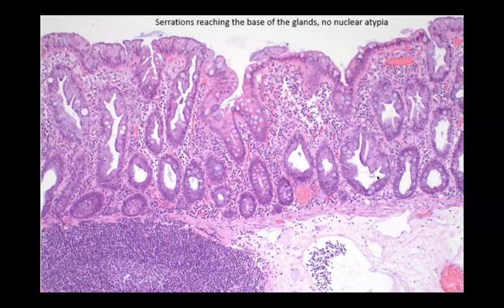Here, proliferation moves to the side. And when the proliferative center is at the side of the glands, it goes upwards and downwards, and then the downward growth is stopped by the muscularis mucosae, and therefore the gland starts broadening. So I think the boot, T or L shapes are descriptions of what is essentially happening, which is a shifting of the proliferation center of the glands from the absolute base to the sides of the glands.